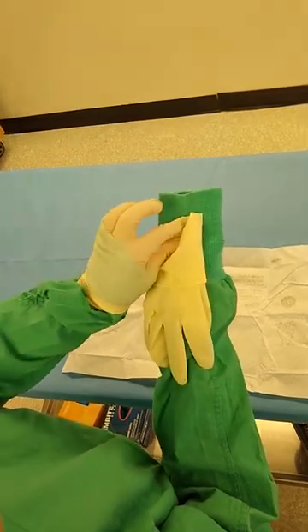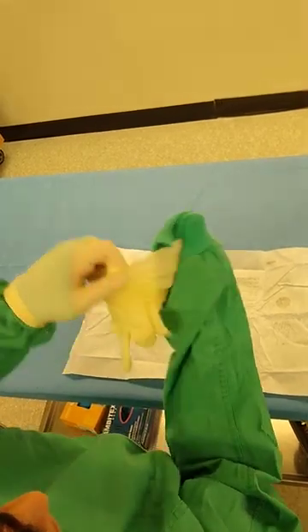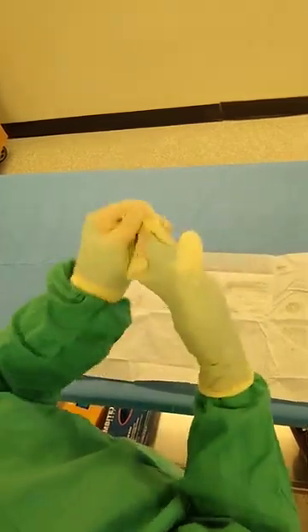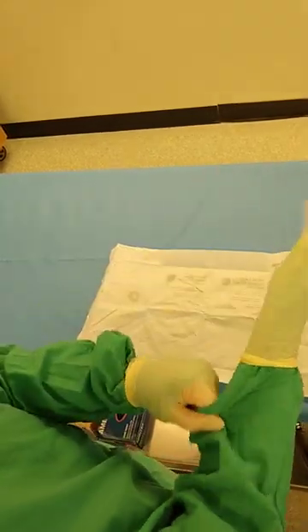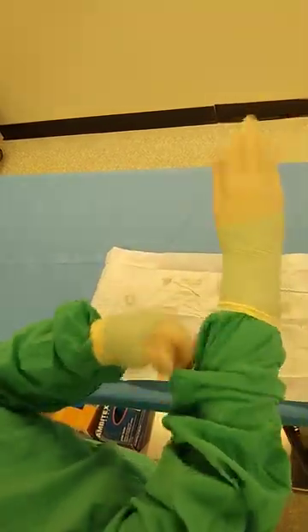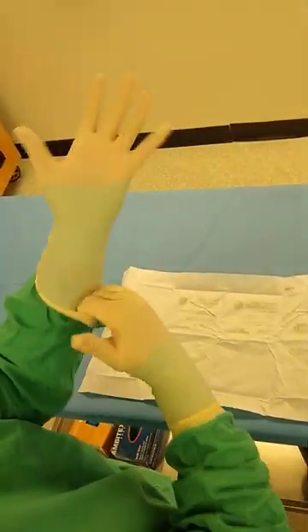Picking up the second glove — again, palm to palm, thumb to thumb, fingers pointing towards me. Take your finger clamp off the front edge of the glove, bring your hand in there, and then just fuss with it until you get your fingers into place.